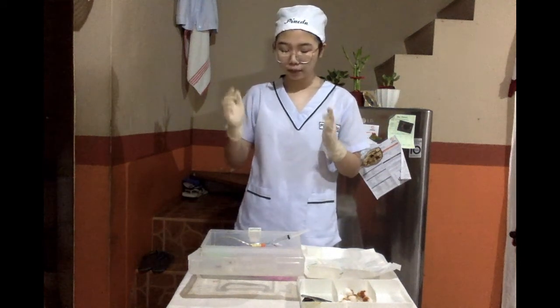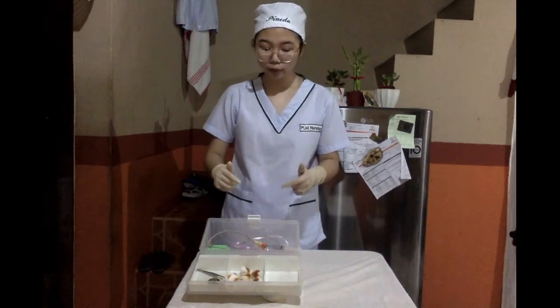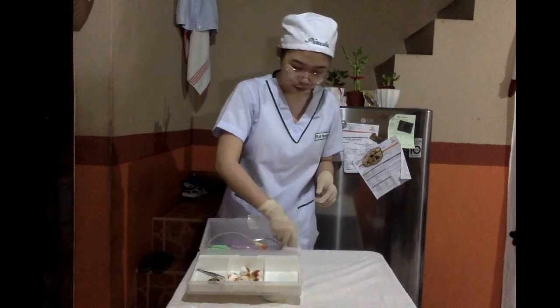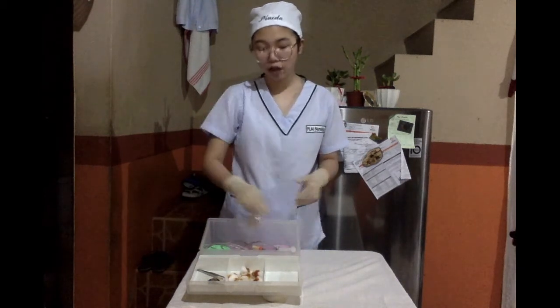Since the drainage apparatus is already connected with the Foley catheter, I would like to keep it here to maintain its sterility and avoid contamination. I will also check the clamp on the drainage bag or in the collection bag to be sure that it is closed. So this is done to prevent soiling of the sterile field and the loss of urine before measurement.